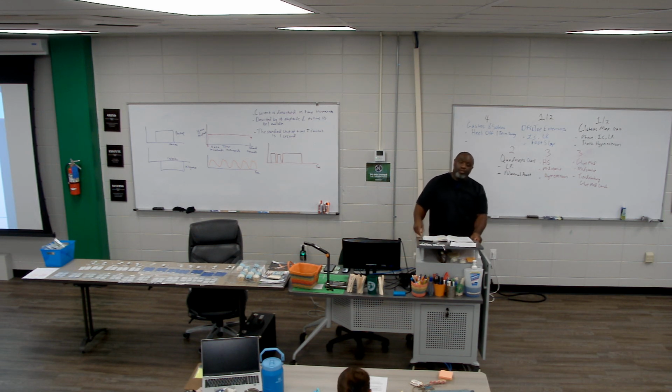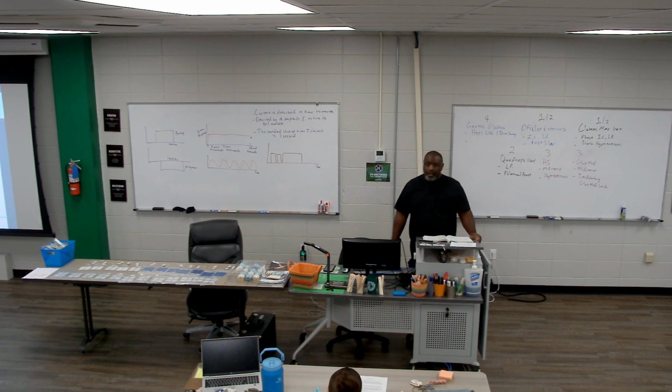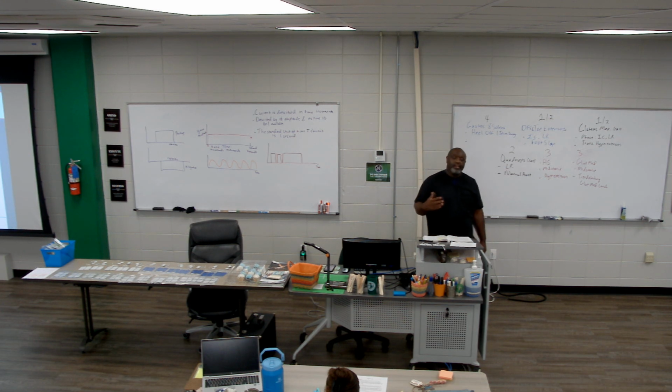Remember, if it's too weak, it's going to give us a sub-threshold stimulation, which is not going to be enough to actually cause something to happen. We don't want to be sub-threshold. We want to meet the threshold so that we can actually depolarize that nerve.